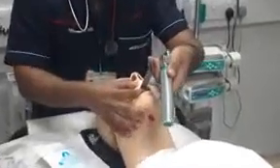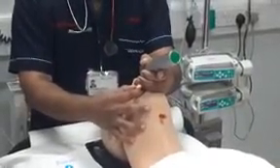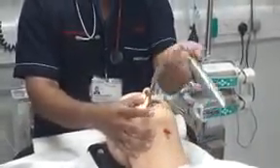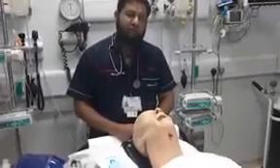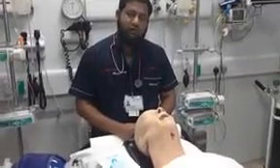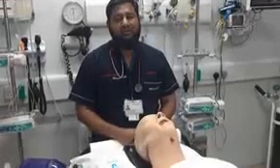The technique of intubation is: if you are right-handed, hold the laryngoscope in the left hand, open the mouth, enter the blade in the sniffing position, and lift forward and upward. You can see the epiglottis, the vocal cords, and the glottis. There is a classification called Cormack-Lehane classification, with four grades of laryngoscopy. Grades one and two are easy intubation — grade one has the glottis fully seen, grade two is partially seen. Grade three has only the epiglottis seen, and grade four has neither the epiglottis nor glottis seen.